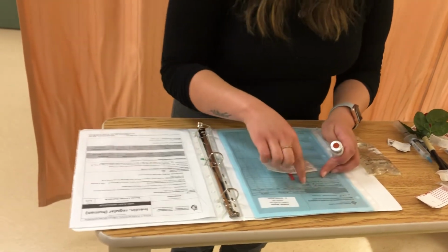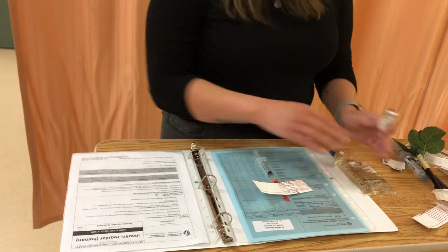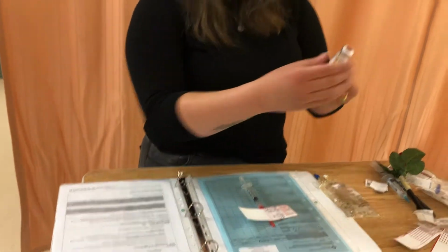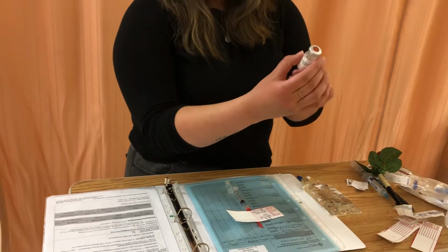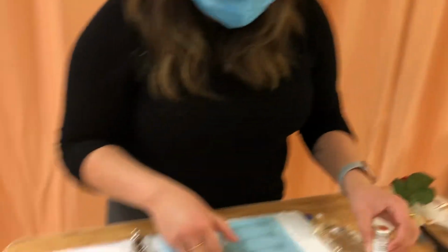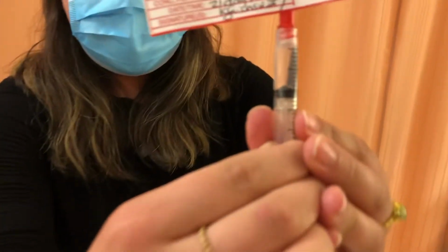So the order is for 2 units an hour. I'm prepping this medication with 100 units in this mini bag, and I require a concentration of 100 units per milliliter. Here we have 100 units per milliliter. And I'm confirming that I have 1 milliliter of insulin in my syringe.